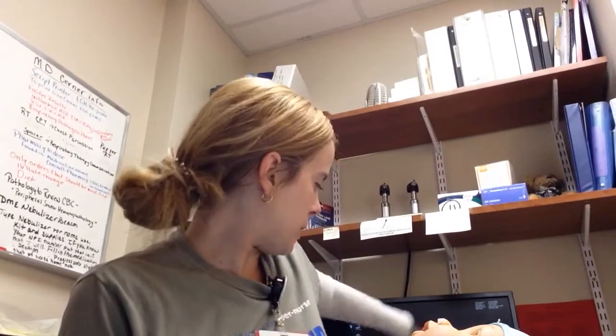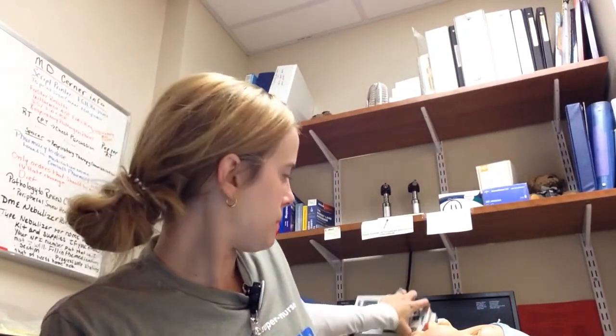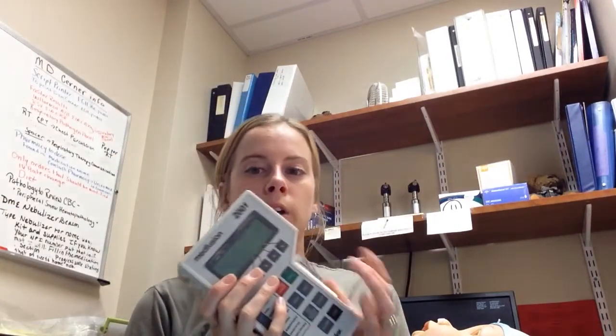So with our auto syringe meds, we have our auto syringe pumps. For any kid that is 3 months of age or 5 kilograms or less, when they get antibiotics, they're going to be using the auto syringe pump. They will not have them IV piggyback. In the future we're going to have new ones that actually have a drug library on them, because right now these do not, and it is a safety issue.